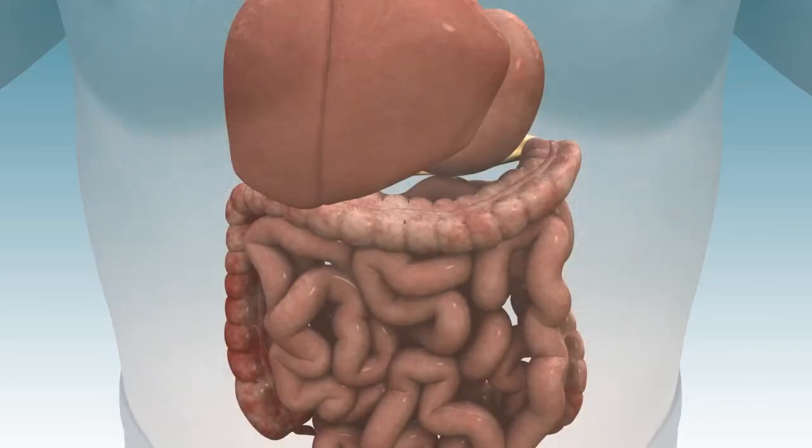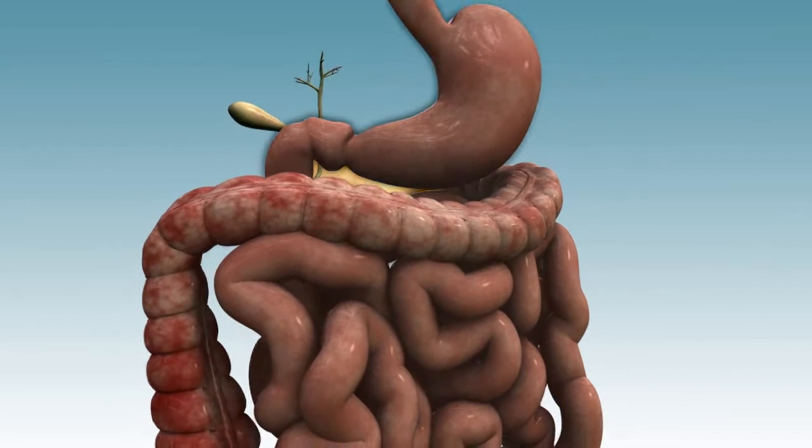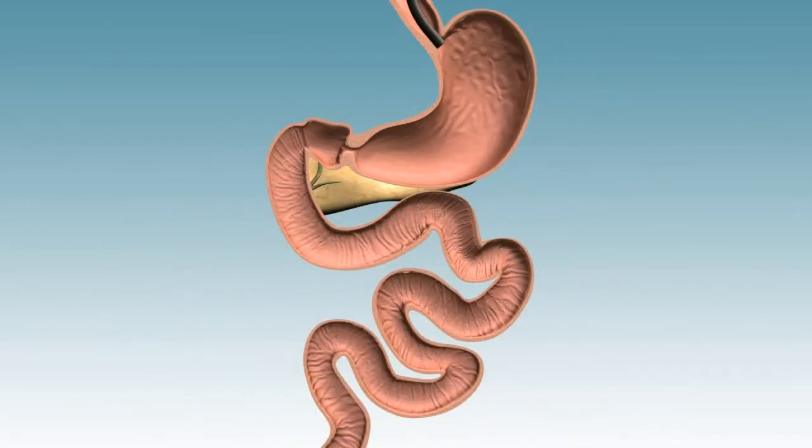In this anatomic cutout, the stomach and small bowel are seen in their normal anatomic position behind the liver and colon. A gastroscope is inserted into the stomach and through the pylorus. A guide wire is then placed down the working channel of the gastroscope and directed into the duodenal bulb, after which the gastroscope is removed.